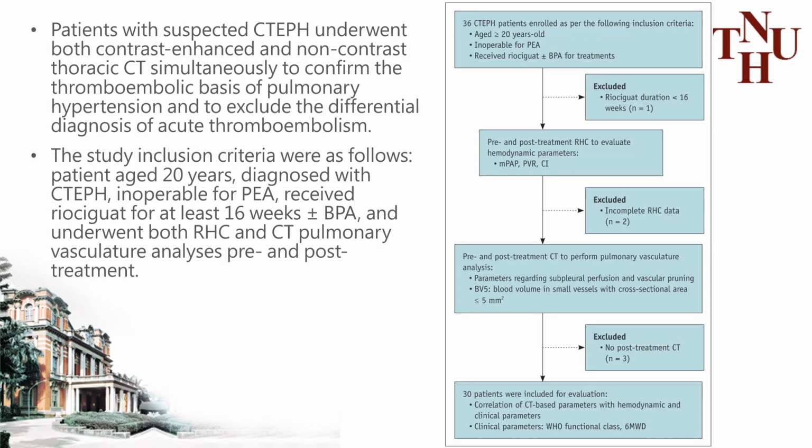Patients with suspected CTEPH underwent both contrast-enhanced and non-contrast CT simultaneously in our hospital to confirm the thromboembolic basis of pulmonary hypertension. Our study inclusion criteria include confirmed diagnosis of CTEPH by multidisciplinary discussion, inoperable for pulmonary endarterectomy.